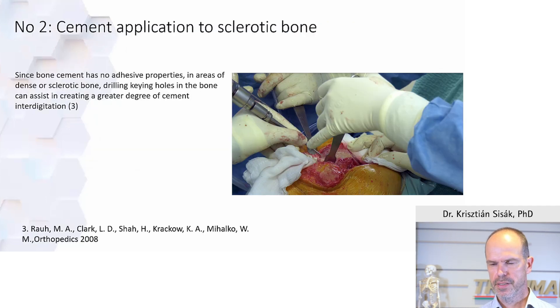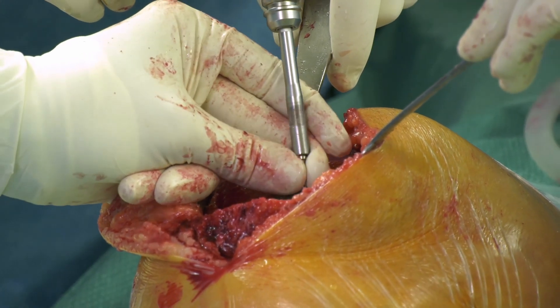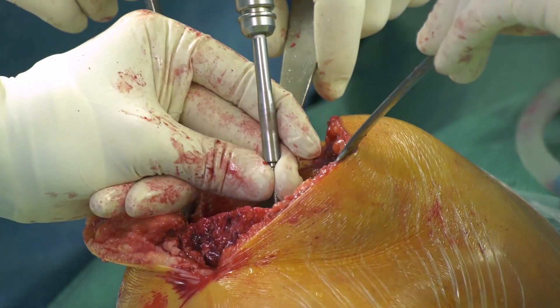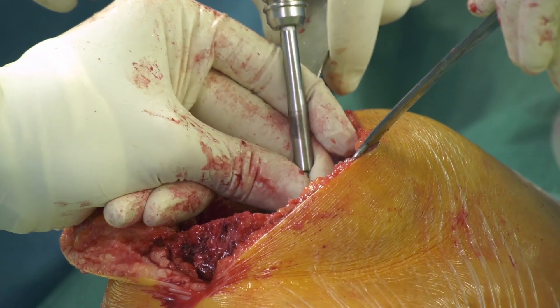How to apply the cement: cement works in good cancellous bone. If you don't have good cancellous bone you will not have a good interface. Therefore, sclerotic regions need to be drilled to about 2–3 mm to create keyholes, which are important for cement penetration. The ideal depth is 2–3 mm.